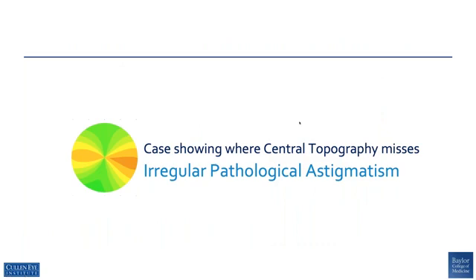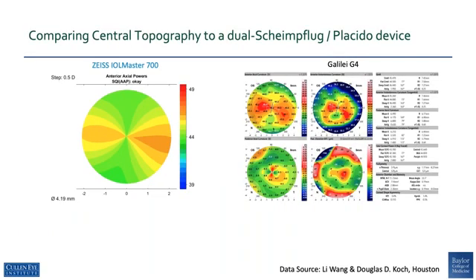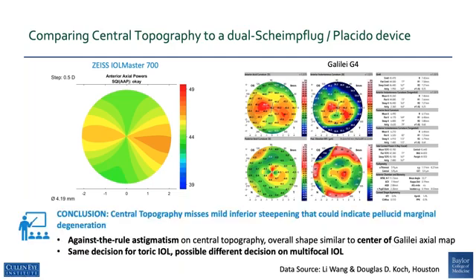Here is a case where central topography actually misses some irregular pathological astigmatism, albeit subtle. Central topography shows against-the-rule astigmatism, and the Galilei also shows against-the-rule astigmatism in the central zone. However, on the Galilei's axial map there is a little inferior steepening, and on the instantaneous curvature map you see inferior steepening below, indicative of forme fruste pellucid marginal degeneration. So central topography misses that very subtle inferior steepening. You might make the same decision regarding a toric IOL but possibly a different decision on whether to use a multifocal IOL based on central topography versus the Galilei.